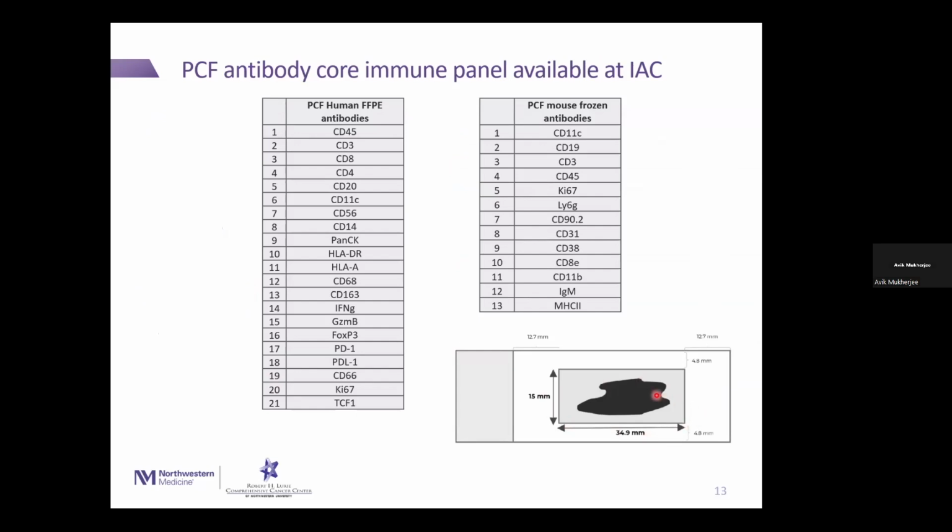Avik has already shown you the area where you can put your tissues, so I would highly recommend you think about this also. You could fit a lot of tissue sections. I have seen people putting 40 tumor, 2 millimeter punch biopsies here for tumor microarrays, and even 6 mouse hearts. So just to give you an idea.